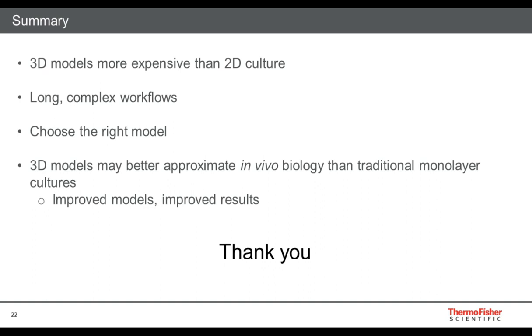So I know frequently people question how relevant of a material it is, given that the composition of the material can vary from lot to lot to the extent that it requires lot testing for one's experiments, so that they could then procure a relatively large amount from the same lot that functions for their needs, in order to be able to reproducibly generate their data. So these undefined or sometimes inconsistent components of these materials are certainly a limitation of it.